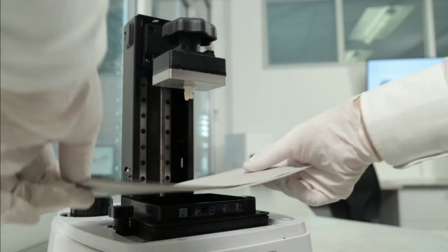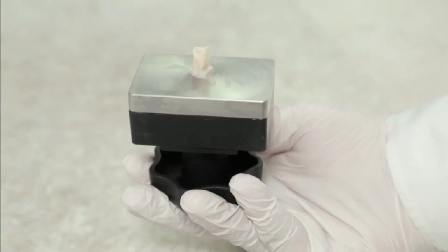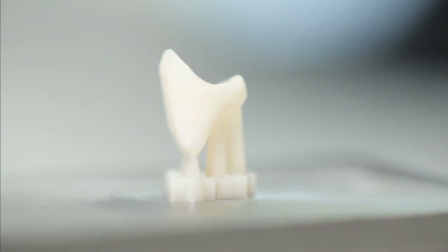Until the printer is done, where then you can remove the build platform, making sure to keep the resin covered and protected. That's a key point here, is you want to keep it free from sources of contamination whenever it's exposed.